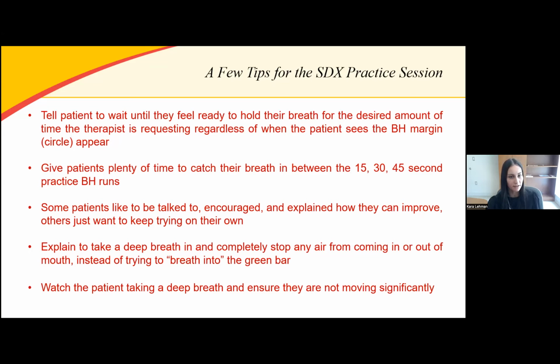The next point I have is just make sure that you as a therapist are being aware and being attentive to the patient and how they are doing during this practice session. Some patients like to be talked to and encouraged and explained how they can improve. A lot of physicians, during the consultation, really talk up the SDX technology, and patients get convinced that this is the best treatment for them.